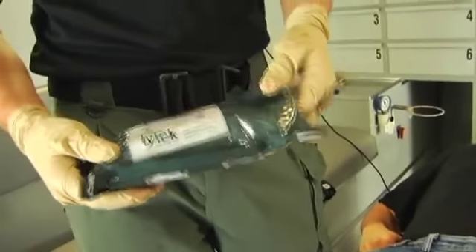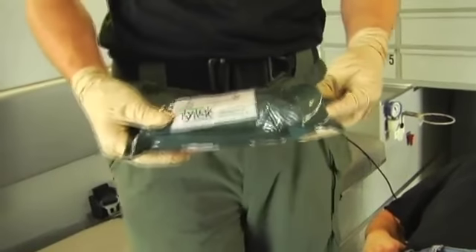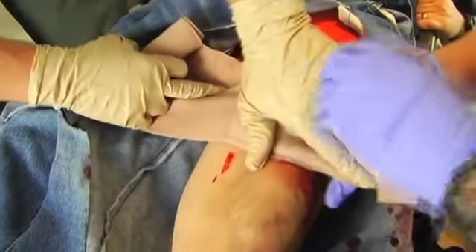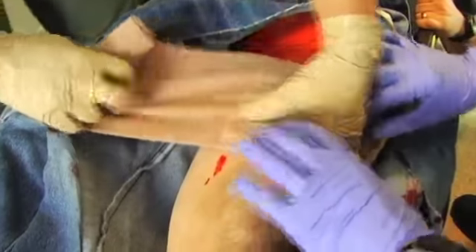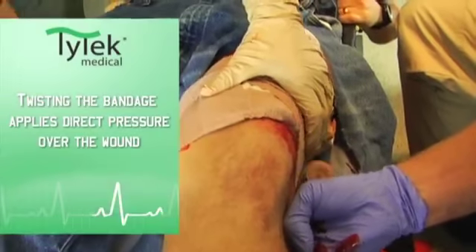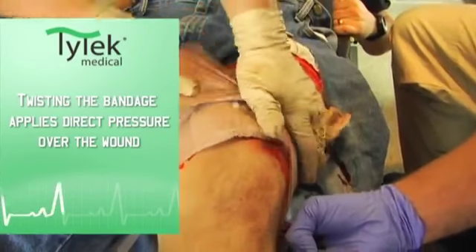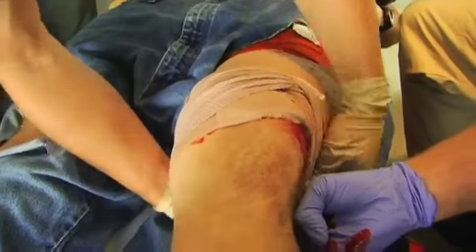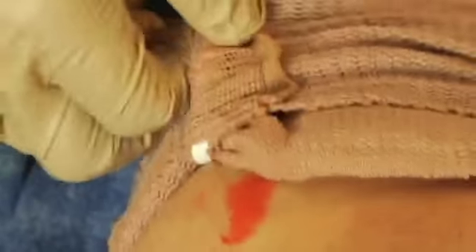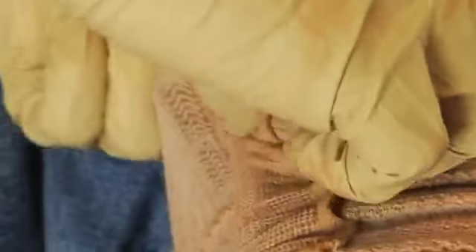A common application of the Titec Medical 6 inch trauma bandage is hemorrhage control from the extremity wound. At termination of the bandage, instead of clips or tabs that are often lost in the hustle, we have integrated plastic clips directly into the bandage for easy application on your casualty.